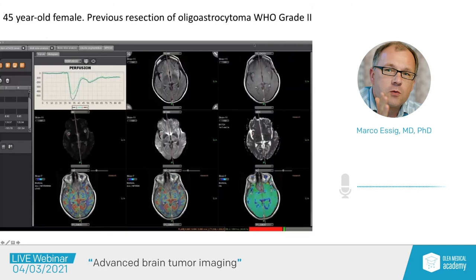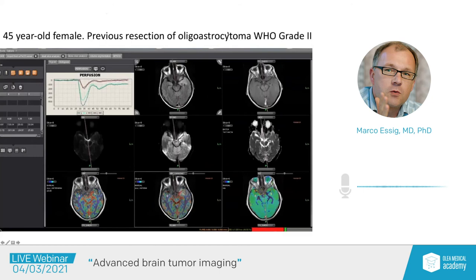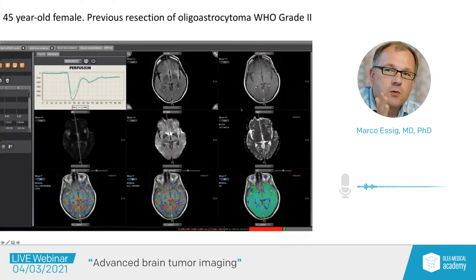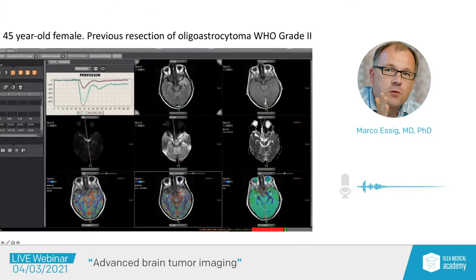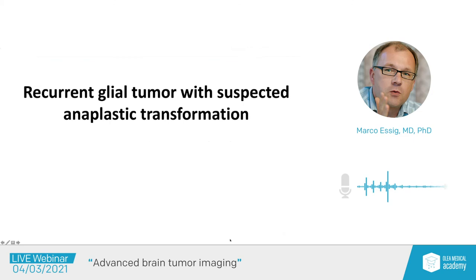A 45-year-old female with previous resection of oligoastrocytoma grade 2 shows an increasing area of T2 hyperintensity over time in the temporal lobe. The key question: is this treatment-related or tumor-related? Perfusion imaging shows higher perfusion values suspicious for tumor-related change, because in treatment-related changes we would not expect increased blood volume or neovasculature. The conclusion: recurrent glial tumor with suspected anaplastic transformation.